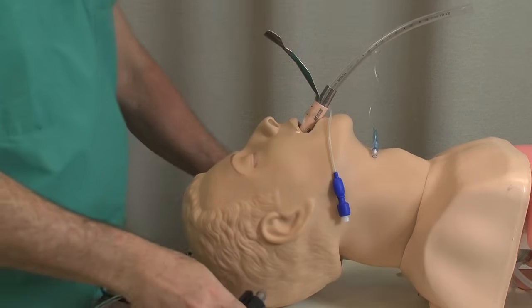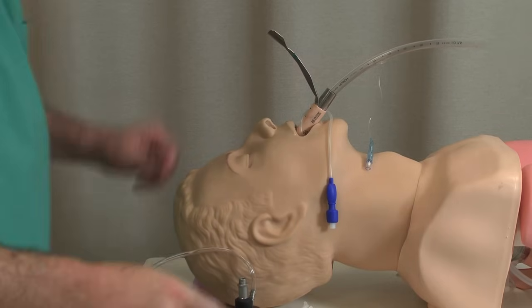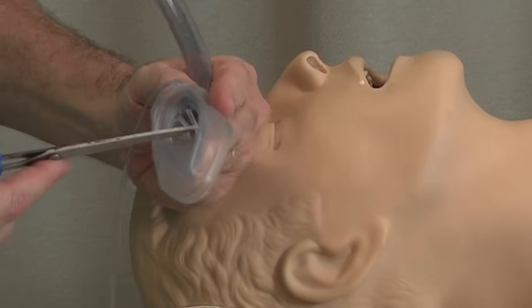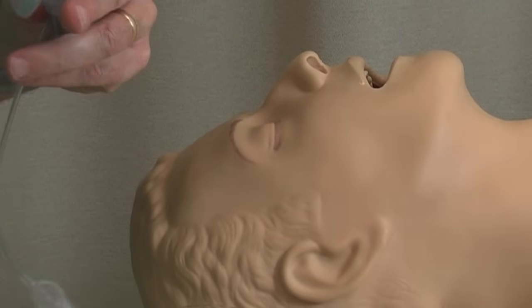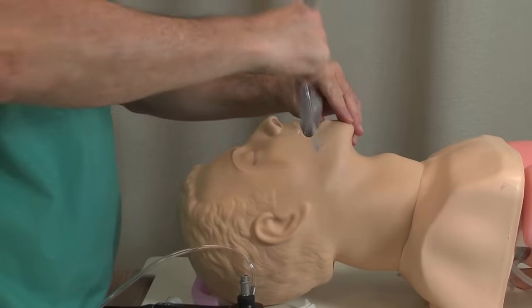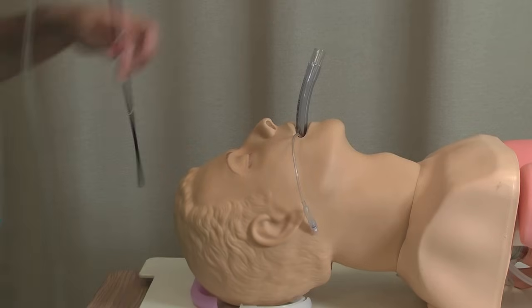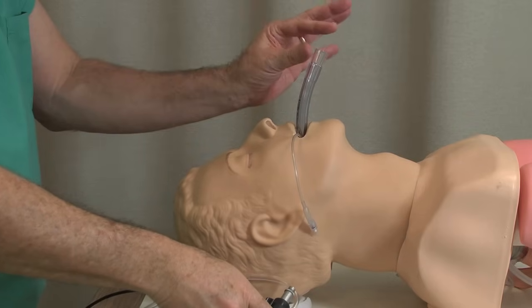The intubating LMA can sometimes be a little bit hard to put in — this handle makes it tricky. So one other way you can use an LMA in conjunction with the fiber optic is to use a regular LMA. A regular LMA has these little bars in it that can get in the way when you want to pass an endotracheal tube through. So sometimes what you need to do is cut these out. With a regular LMA you can actually intubate through it once you've cut those bars away. Whereas the intubating LMA can sometimes be problematic to get in, this regular modified one tends to go in a lot easier — and then through it you can place an endotracheal tube and the fiber optic, essentially the same idea as the intubating LMA.